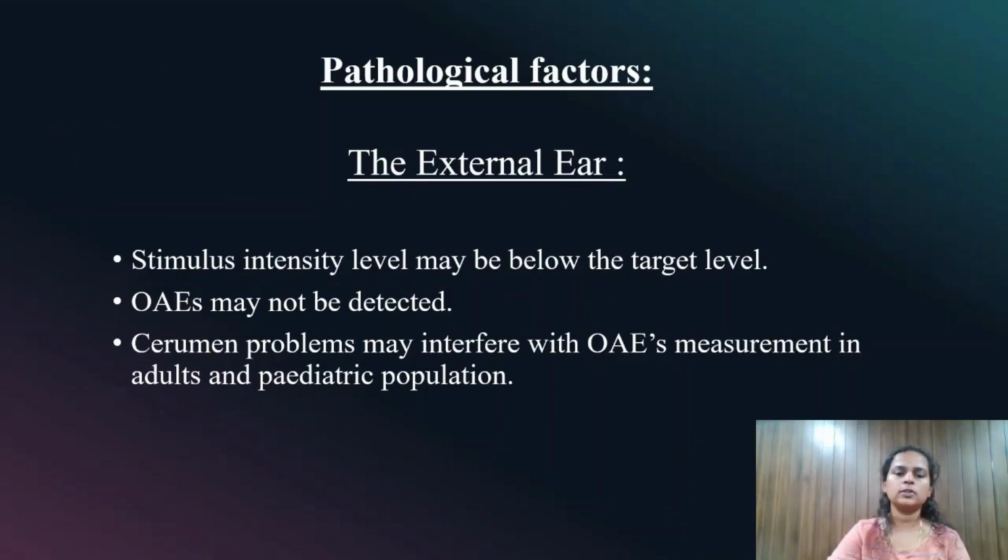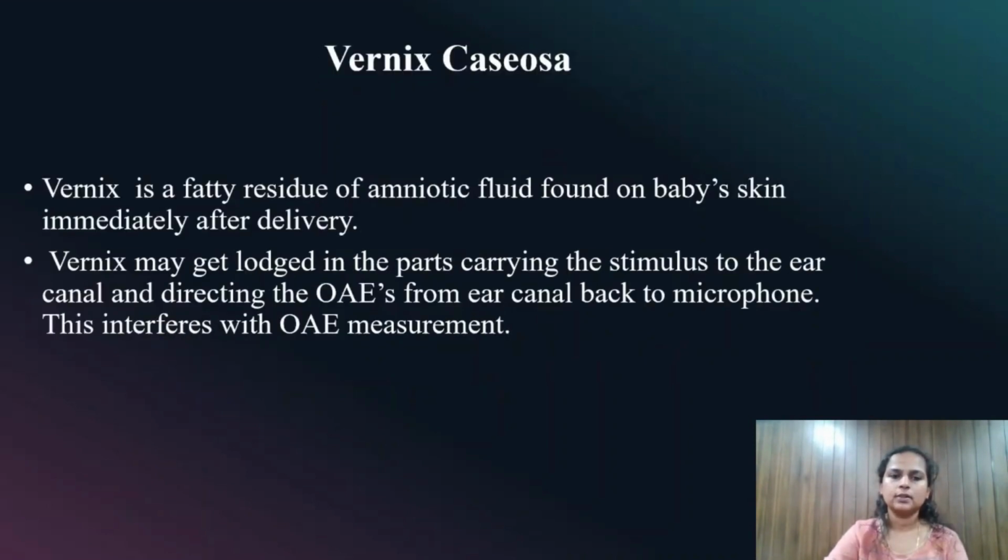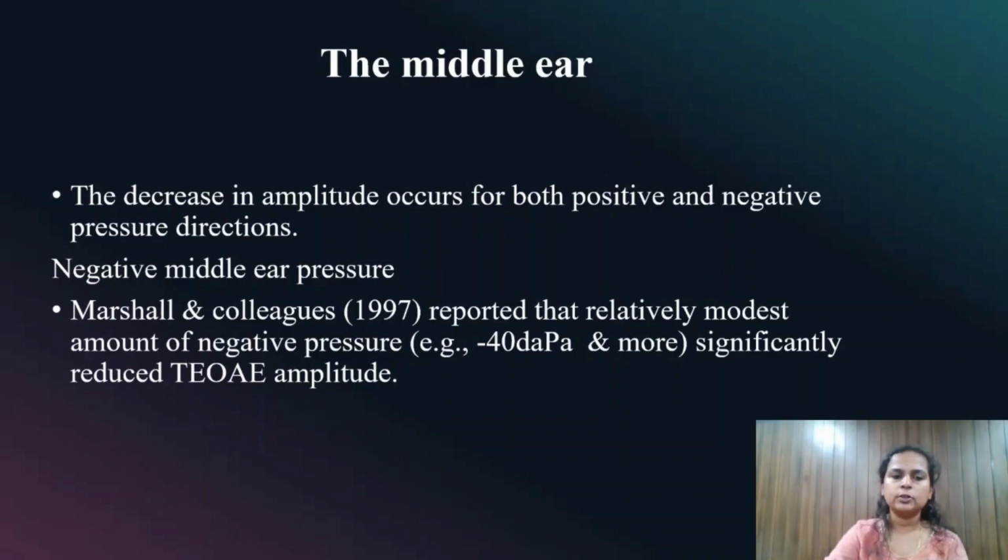Pathological factors, the external ear: the stimulus intensity level may be below the target level and OAEs may not be detected if cerumen problems interfere with OAE measurement. Vernix caseosa is a fatty residue of amniotic fluid immediately after birth, and this will block the ear canal from the microphone which records the OAE. In the middle ear, the amplitude is decreased for both positive and negative pressures. The negative pressure significantly reduces the TEOE amplitude.